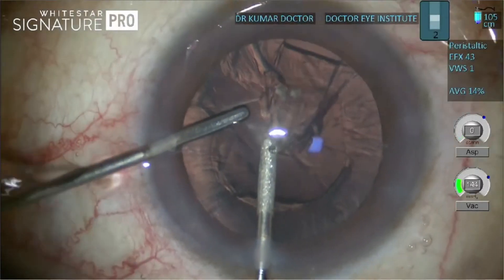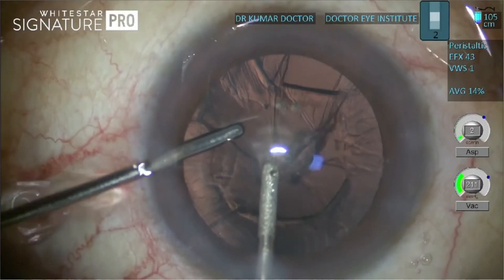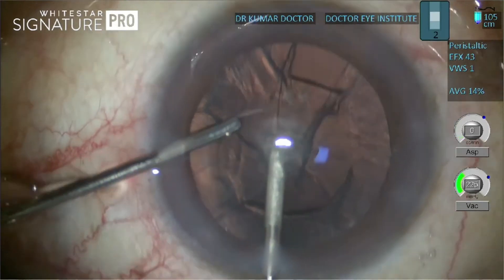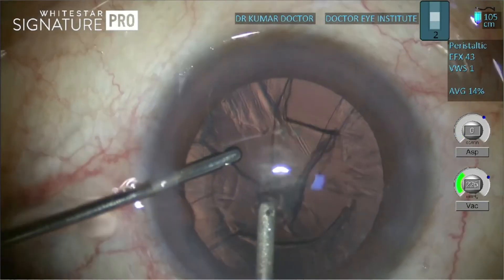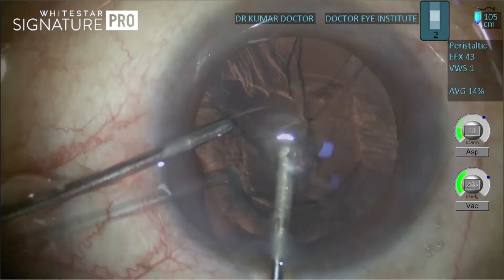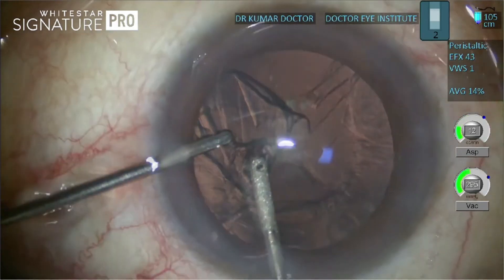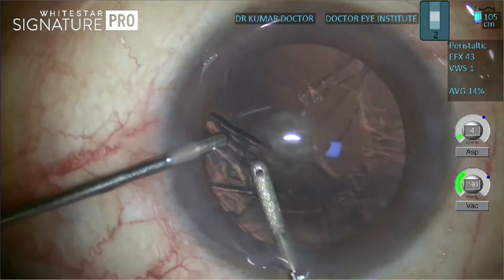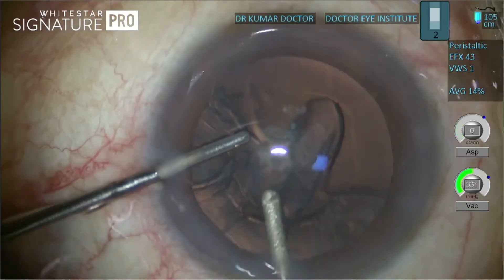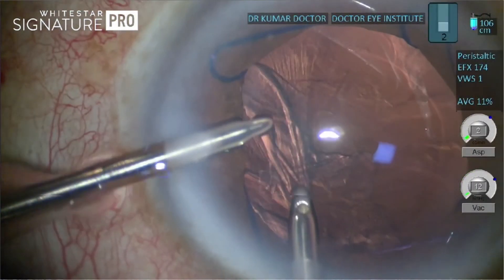During cortical aspiration, note the movement of the posterior capsule and its flowability with the cortex. As the cortex is stripped from the posterior capsule, there is neither any movement of the posterior capsule nor a flutter, thereby indicating strong posterior zonules.